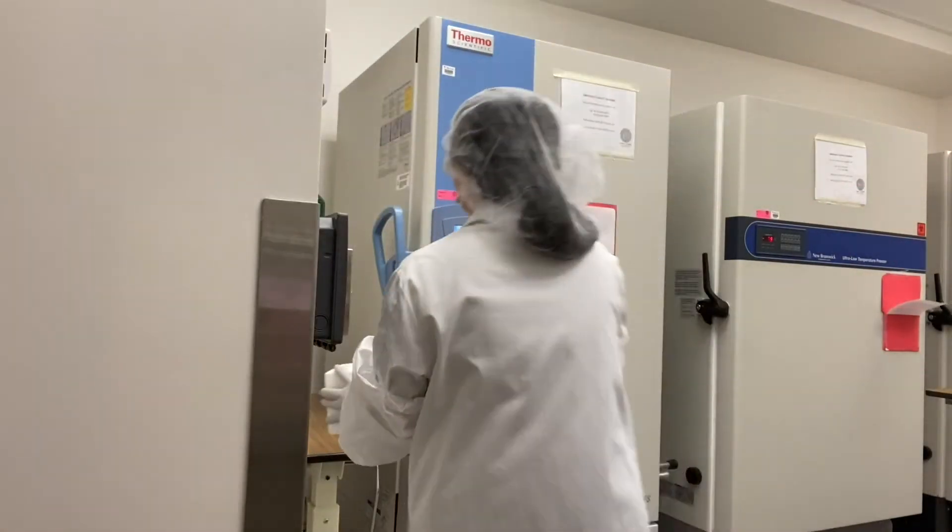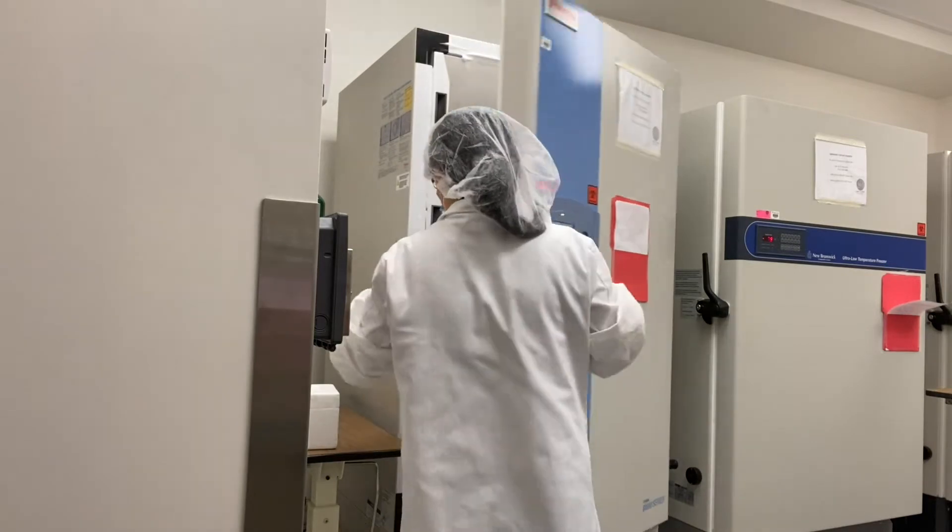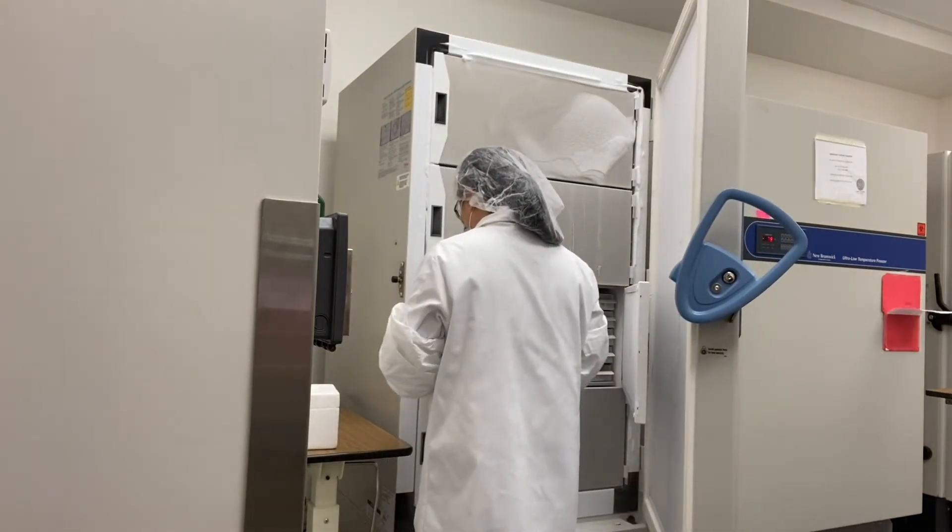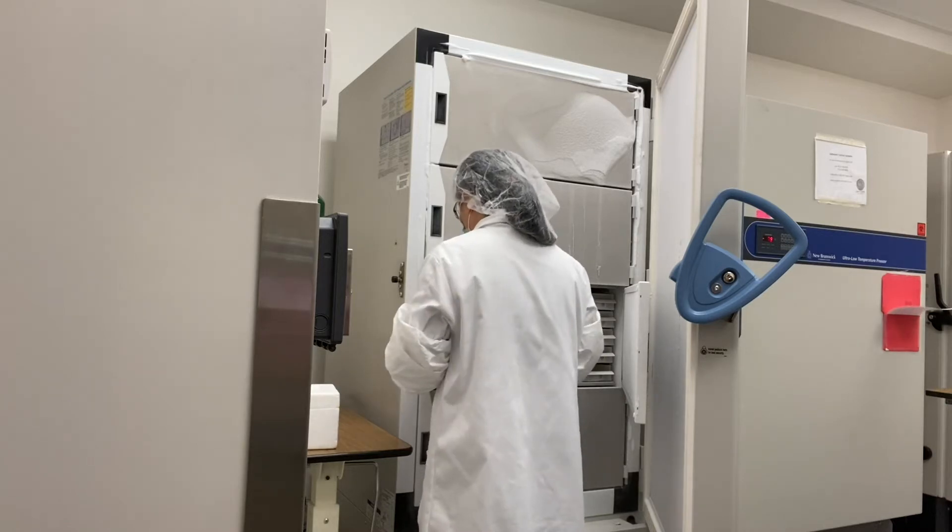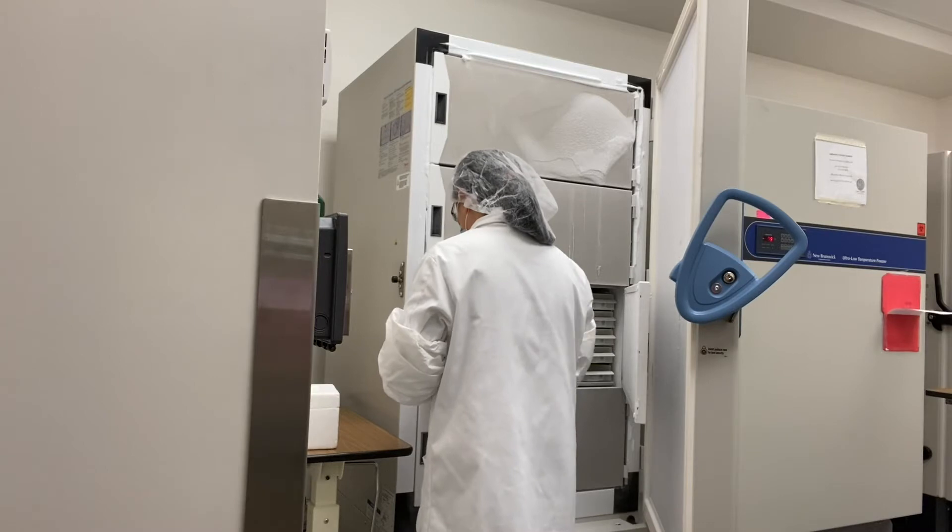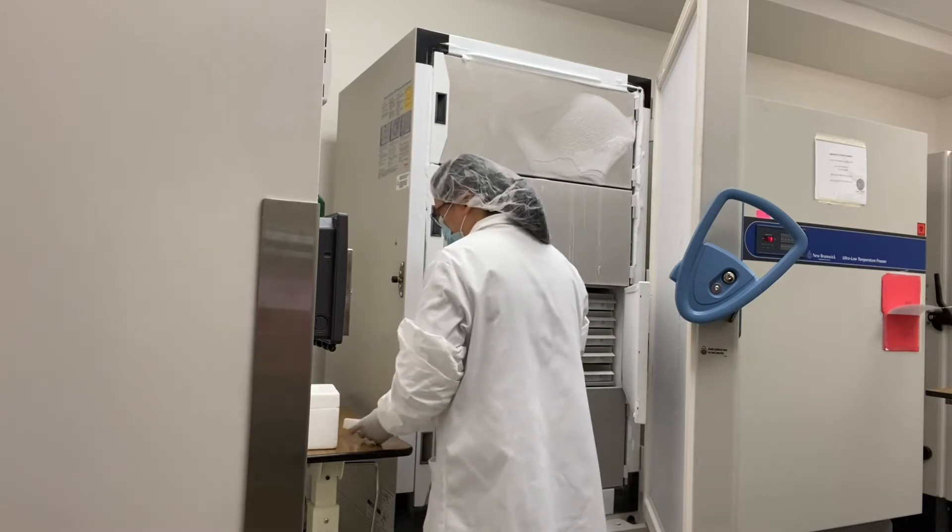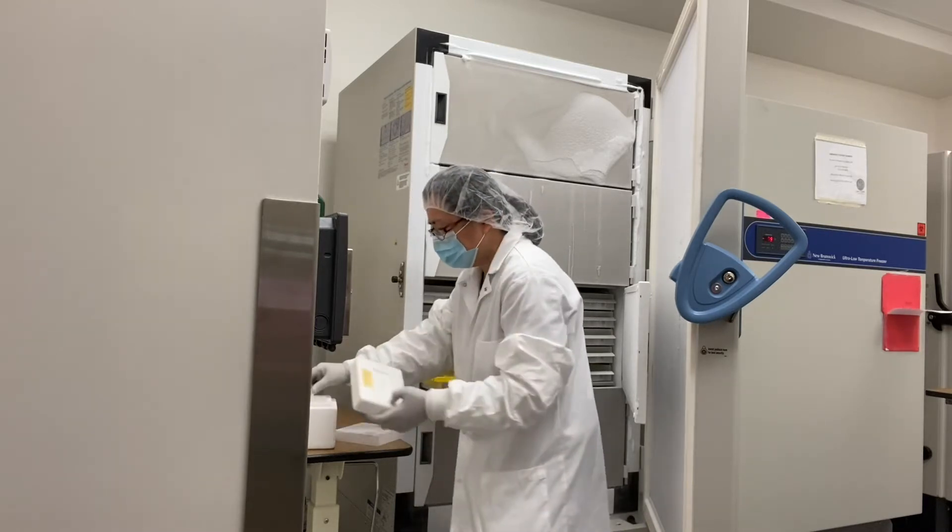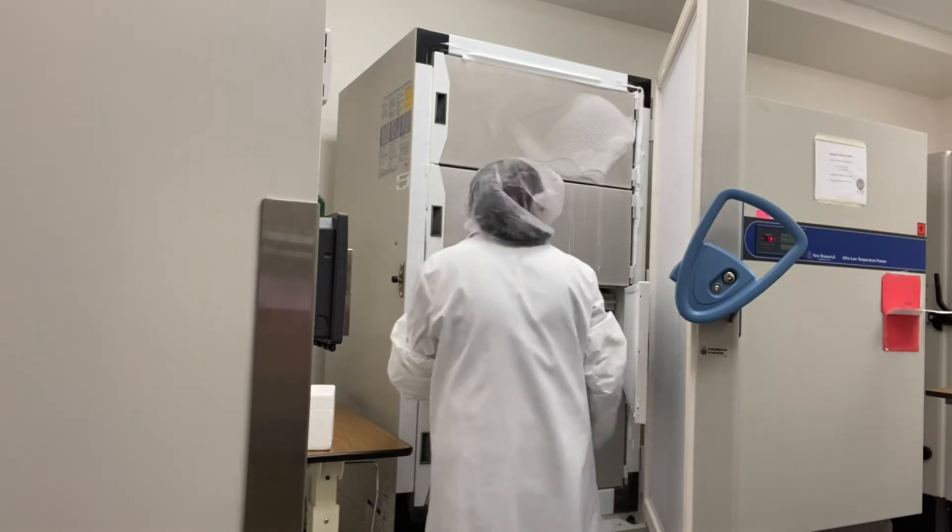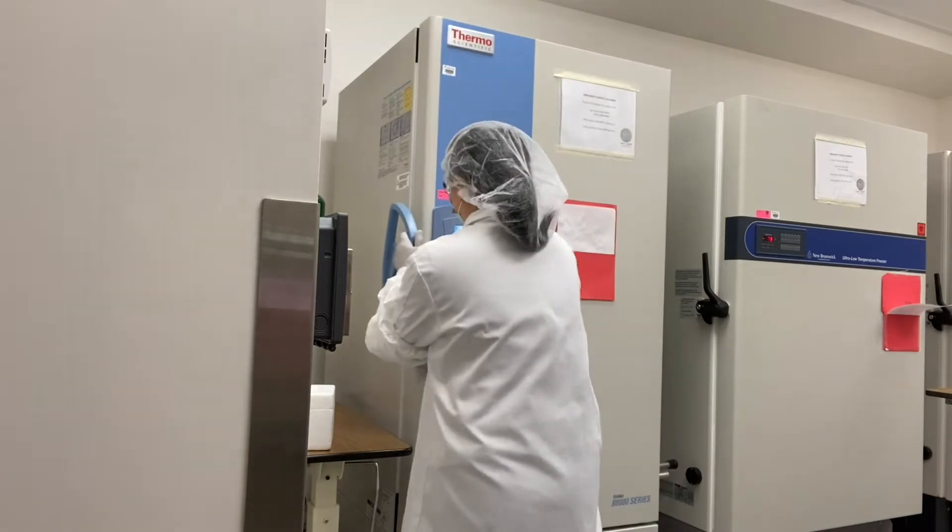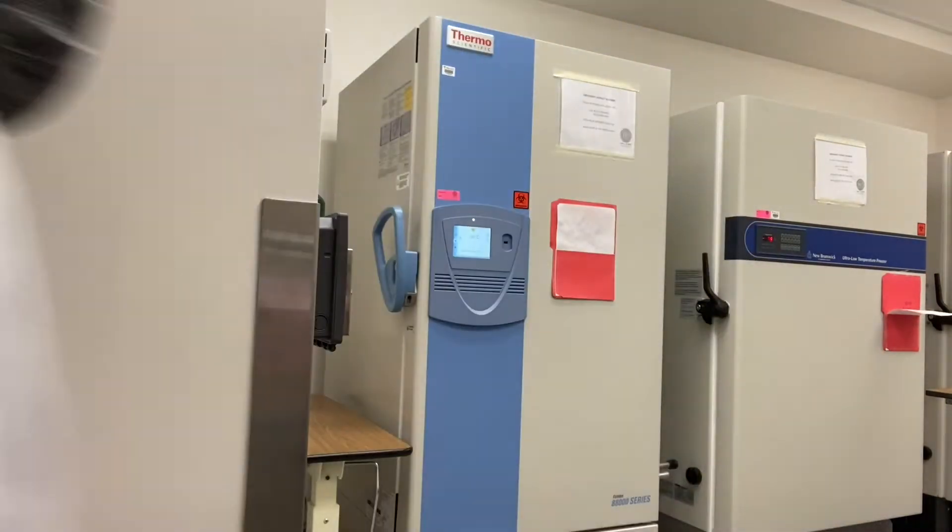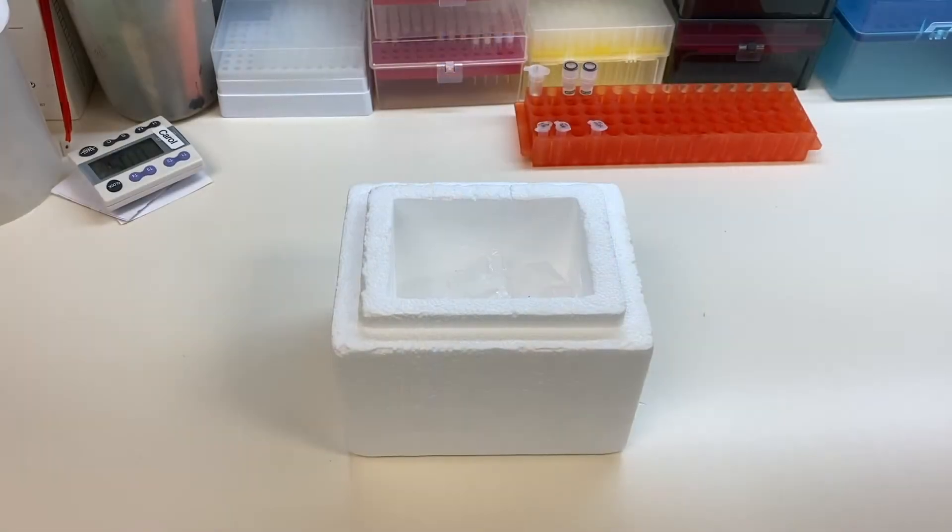Take an aliquot of matrigel from the minus 80 degrees Celsius freezer and place it immediately on ice. When preparing the aliquots of matrigel, take into consideration the dilution factor provided by the manufacturer to calculate the volume of the aliquot. The dilution factor changes depending on the lot. Each aliquot should have enough volume to allow for a 1 in 100 dilution in DMEM.